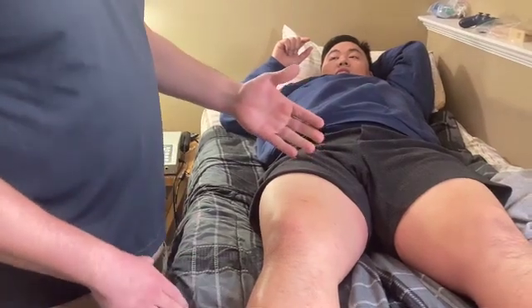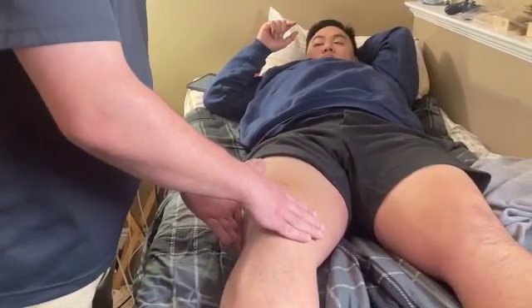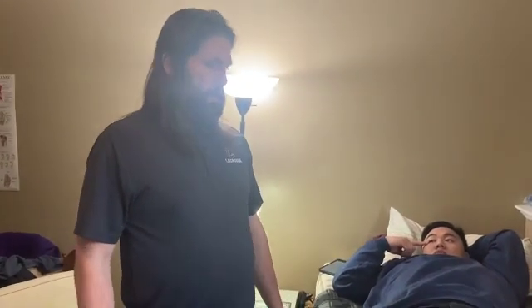Consent. So is it okay if I feel around your knee area here? We're going to do a quick skin inspection just to make sure that you don't have any lesions or pain. And do you feel all this? Mm-hmm. Okay. So he's got all of his right sensory stuff there. He doesn't have any lesions, so we're good to go for this treatment.